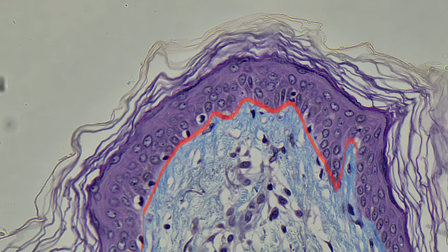Here is our basement membrane. This is a sample from the skin. This is the dermis down here, whereas here is the epidermis.